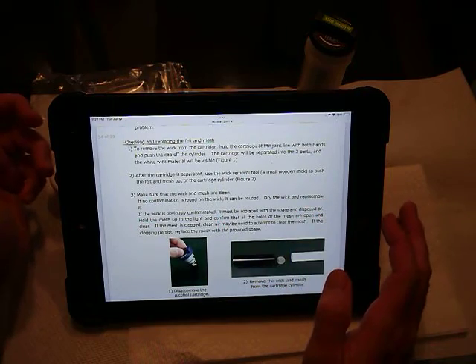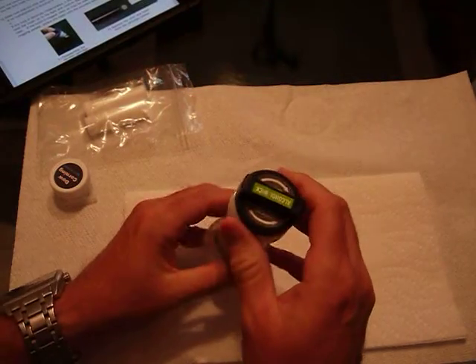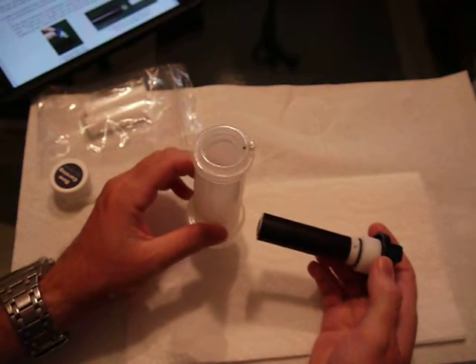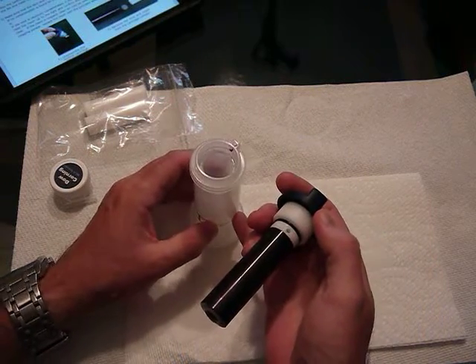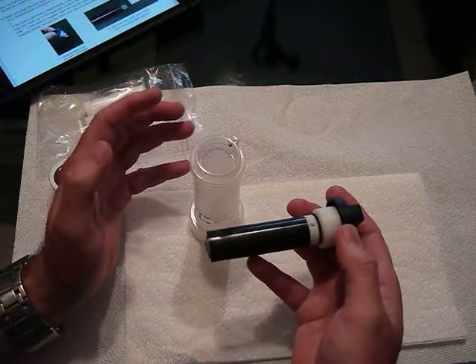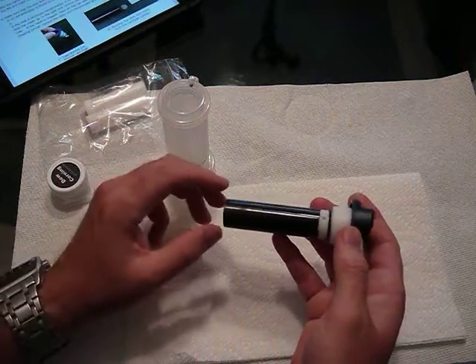This may be needed if the alcohol inside here, say over time, absorbs a lot of moisture from the air and gets older. Now you've got older alcohol that's got a lot of moisture in it, because this is supposed to be reagent grade alcohol, very high purity. As it absorbs moisture, it gets weaker. It doesn't measure particles as accurately or as well.